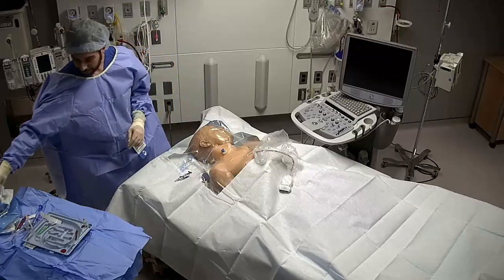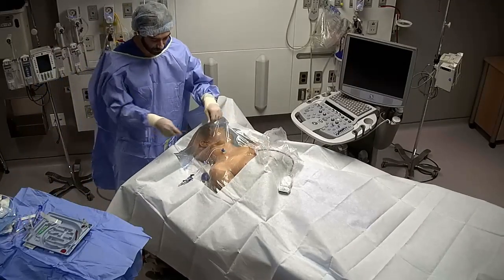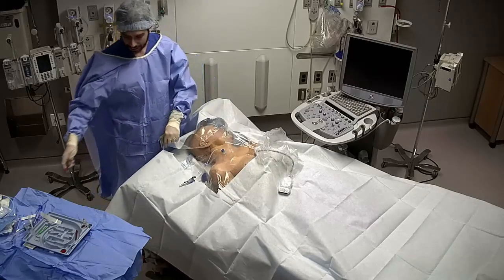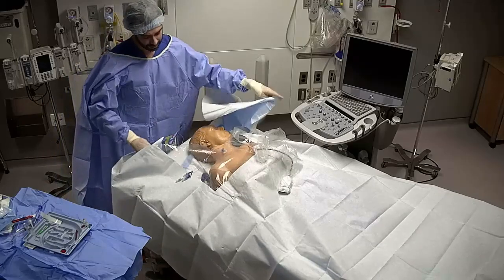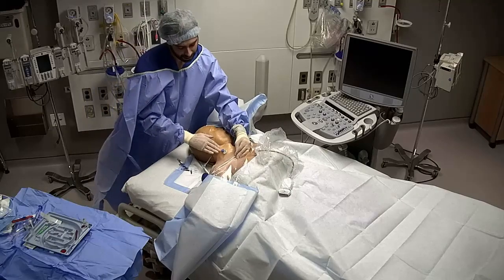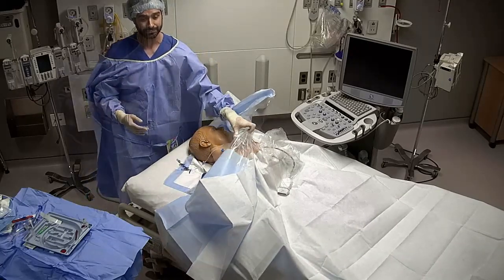And you're going to remove the patient from underneath the sheet. Some of these have tearaways, so it's easier when there's a tearaway to just rip it. If they don't have a tearaway, you can use a knife to cut it. And then just rip. And then take your Tegaderm that should be right here and place over the catheter itself. And throw everything away, and you're all done.